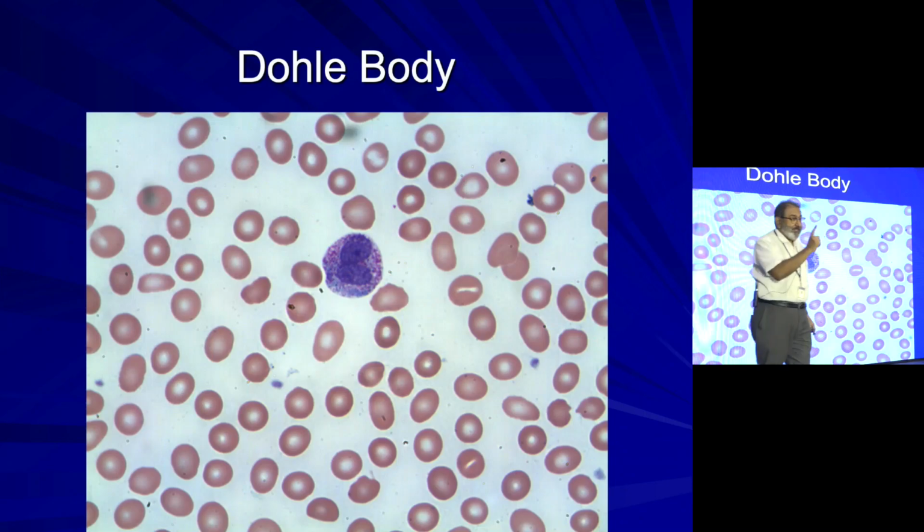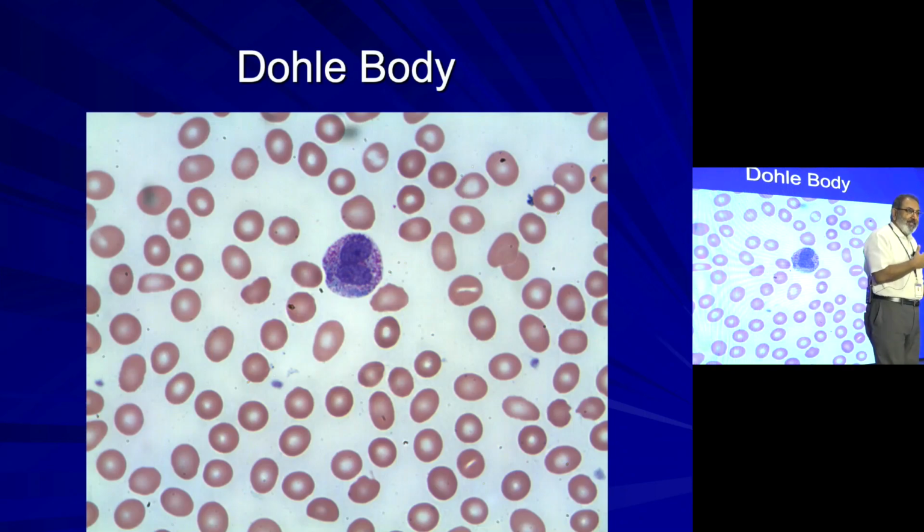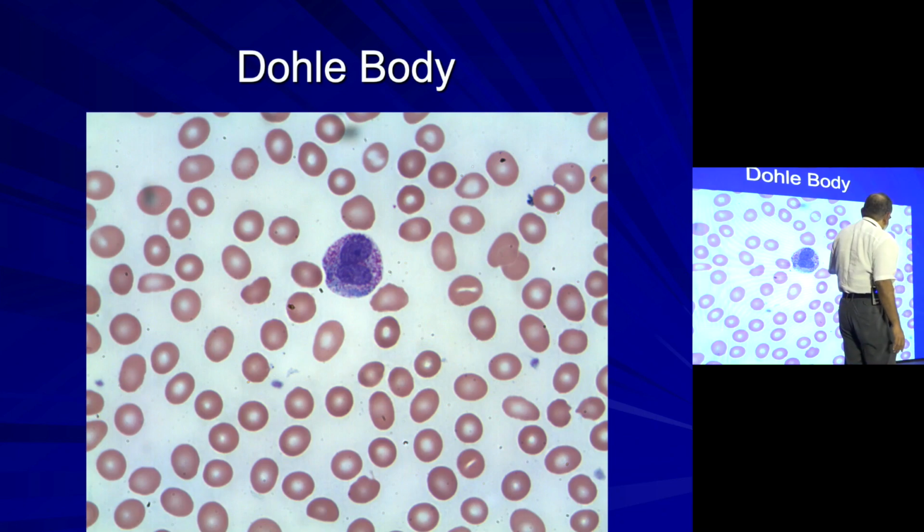Now, sepsis, Döhle bodies. Have you ever seen? I'll tell you one thing. These are my own slides, nothing from the internet. Look at Döhle bodies. Have you seen Döhle bodies like this in your life? So beautiful, no? Phenomenally beautiful in neutrophils. That's because I have developed my own Romanowsky stain, which is very, very cheap. I call it modified Wright-Giemsa. And what does that mean? That means there is remnant mRNA in the neutrophils.